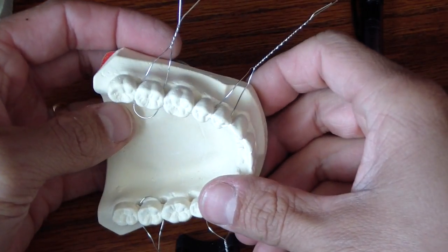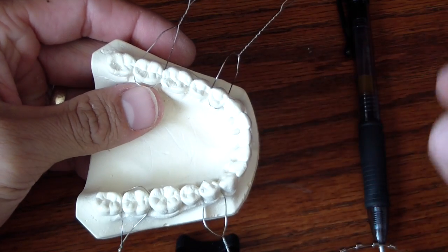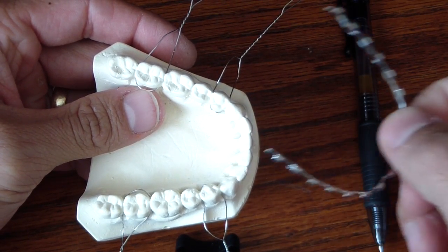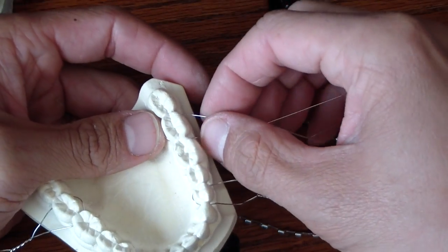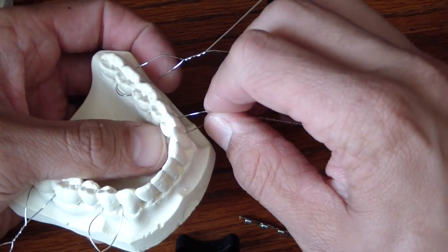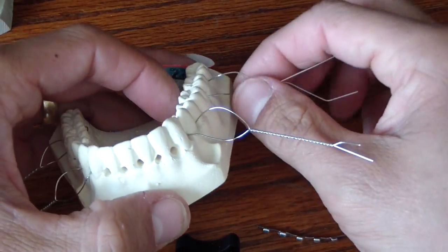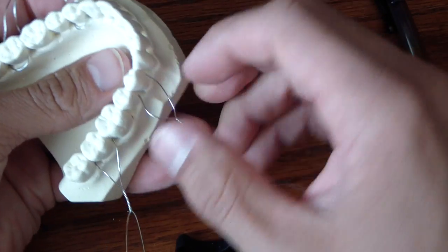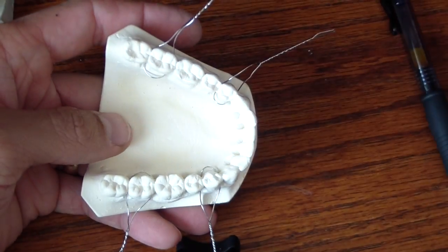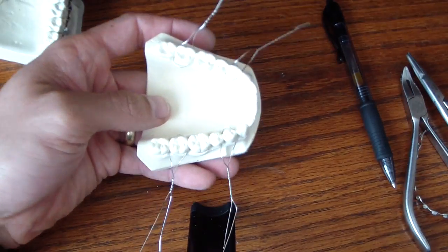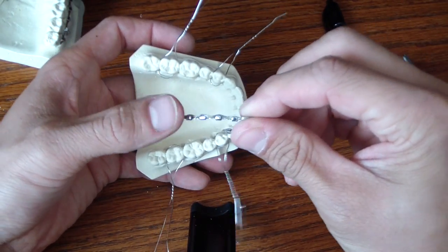We've got a few wires put in here, left loose. I already poked myself so that's one of the key things, especially when doing this with a lot of hardware - some folks double glove. Make sure you're careful, it's very easy to poke yourself. What I typically do is try to bend the wires so these loops look like this so you can slide the arch bar right through, typically distal up. Take our pre-measured arch bar - I almost put it upside down, so make sure that the lugs are facing apically.